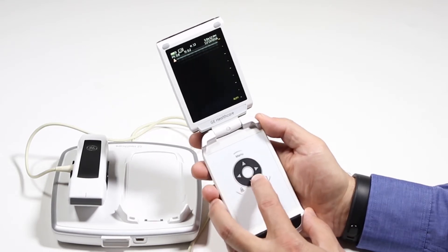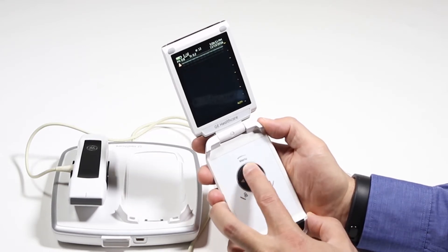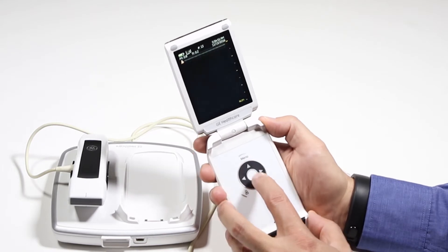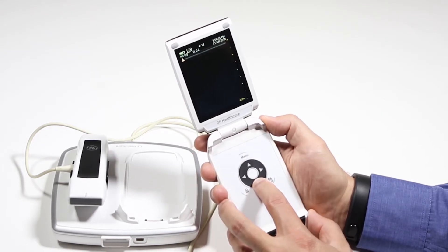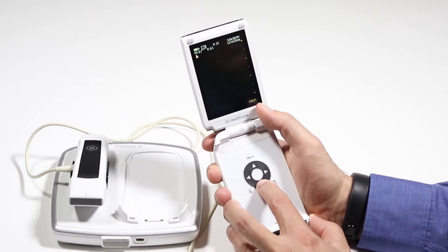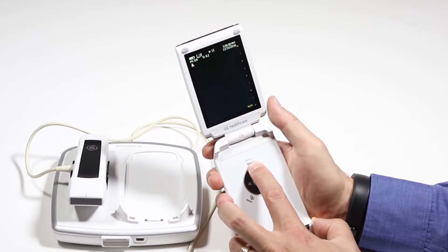So in 2D, you have a couple of options. As we discussed, this is your gain control, your depth — you're going to use the up and down arrows to change the depth. As you can see, this is changing the depth here.